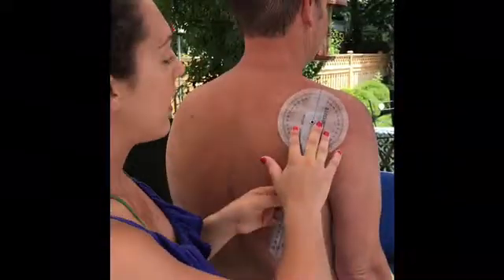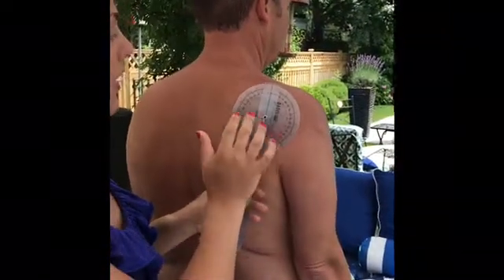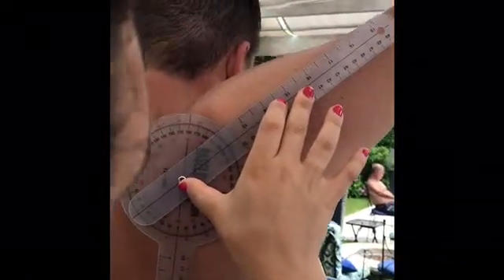We're going to measure abduction of the shoulder now. Typical range of motion is 0 to 180. The axis is going to be on the posterior aspect of the acromion process. The stable arm is going to be parallel to the spine, and the moving arm is going to be posterior aspect to the humerus. So go ahead and bring your arm all the way up as far as you can go. Yep. So normal range is 0 to 180, and you are at 134.